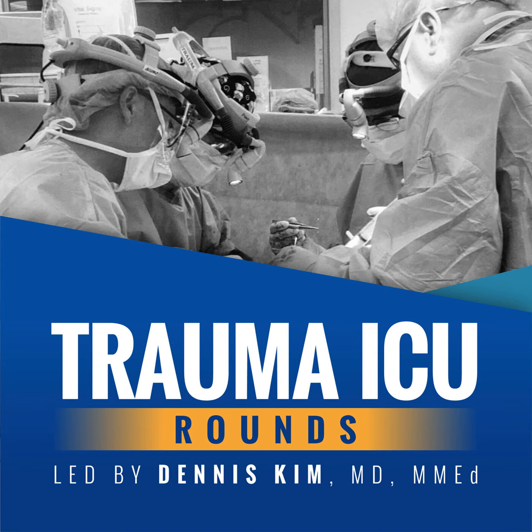So moving along to our third objective, to understand the core physiologic concepts comprising the respiratory equation of motion, I want to take a couple of seconds or minutes just to review a couple of key points when it comes to mechanical or positive pressure ventilation. The one thing to bear in mind is that there are a host of wide-ranging systemic effects of mechanical ventilation. And I think the best example of this is the cardiopulmonary interactions and dependency that we see and in fact can manipulate at the bedside.